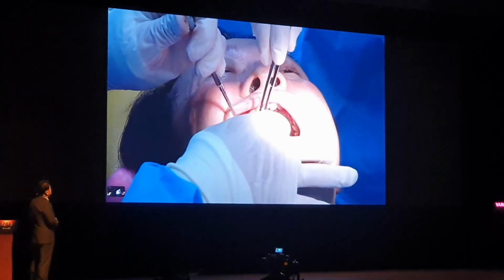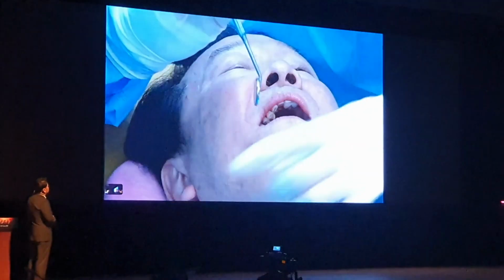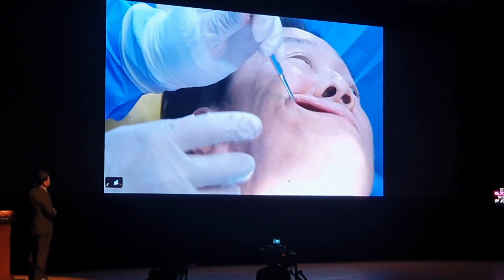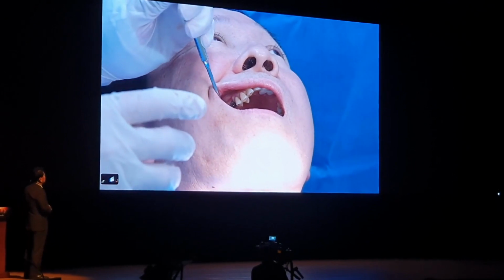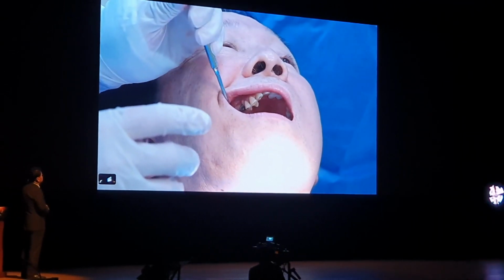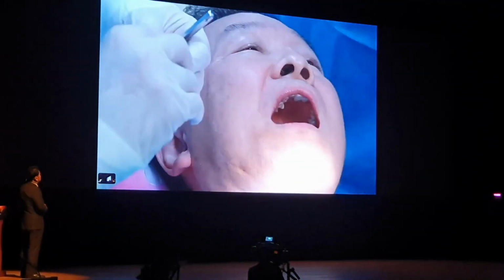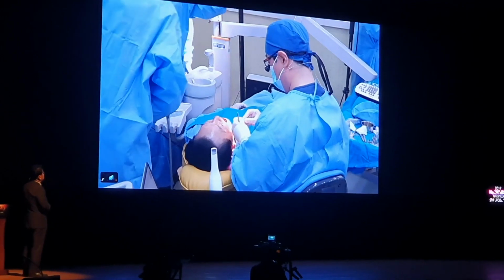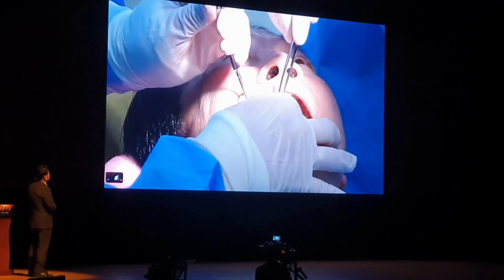Scan pin? Yeah, scan pin, please. The encoded healing abutment is normally in two pieces, but for scanning, we make it into three pieces. This way we can extend the length to reduce the angulation error on CAD software. So now I'm connecting the scan pin onto the encoded healing abutment.